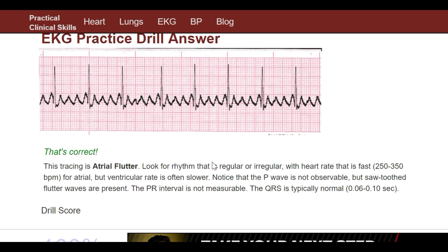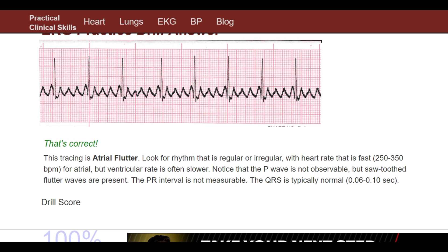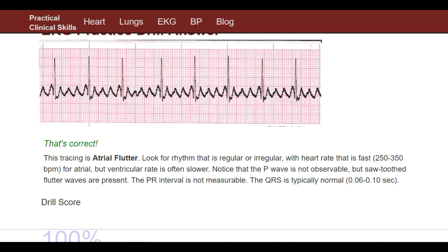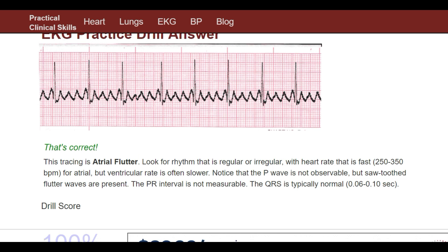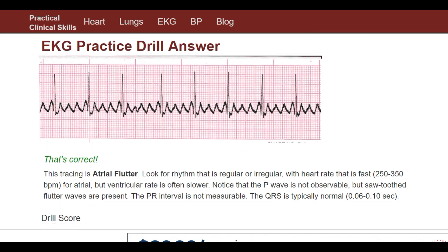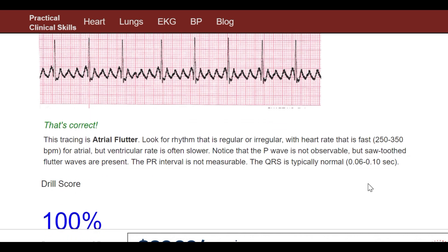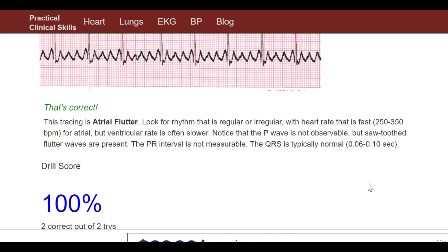The P wave is not observable, but sawtooth flutter waves are present. These aren't defined P waves — it's just going really fast. The PR interval is not measurable, and the QRS is typically normal. That is classic atrial flutter.